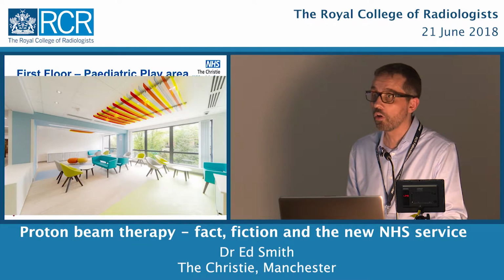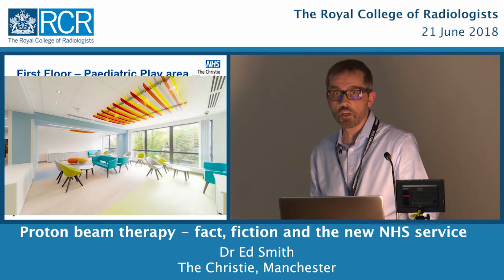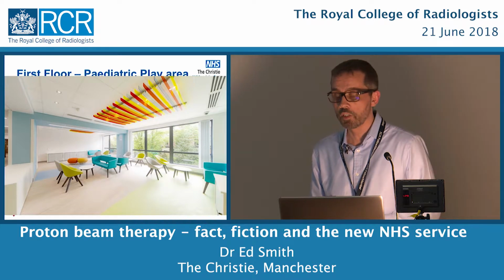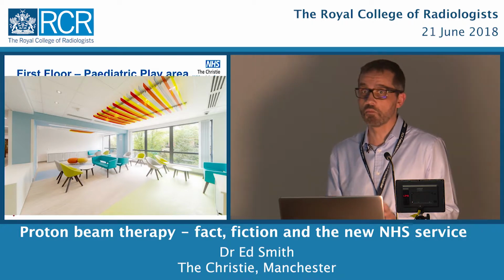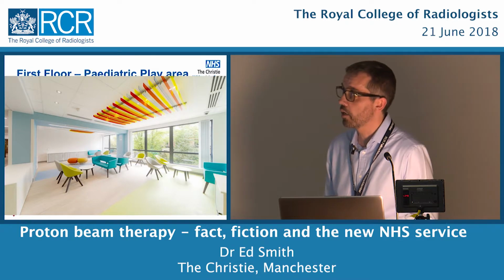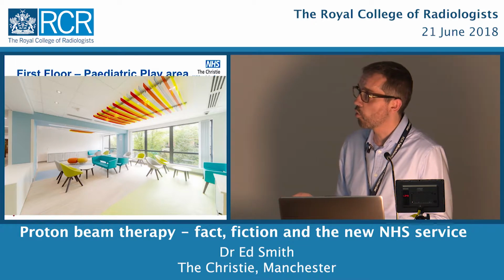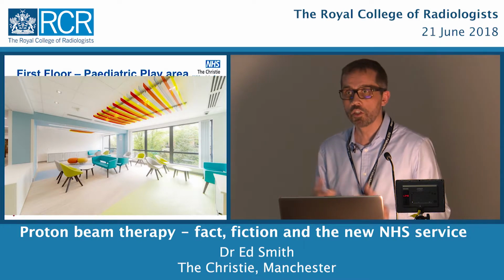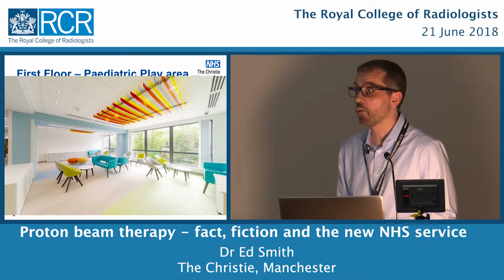We also need space for anaesthesia, and we've got a rather large anaesthesia service to accommodate, because many young children just cannot lie still for their treatment. Proton technology has come on leaps and bounds, and actually treatment times are quite good, about 30 minutes or thereabouts, which is in line actually with our standard X-ray treatments. But we still need an anaesthesia service, and because patients will travel far and wide to us, we may not have the time, all of the time, to do the intense sort of play specialist work that might be required just to calm their nerves.